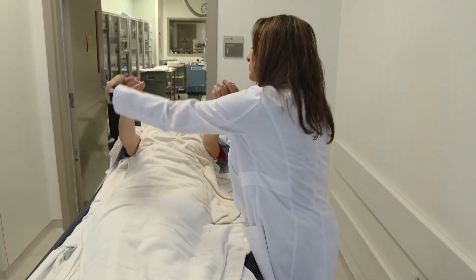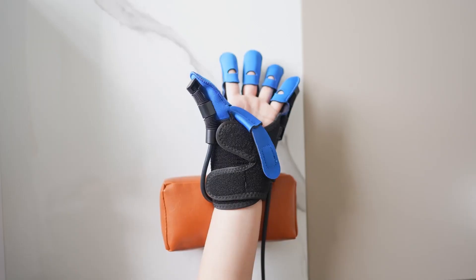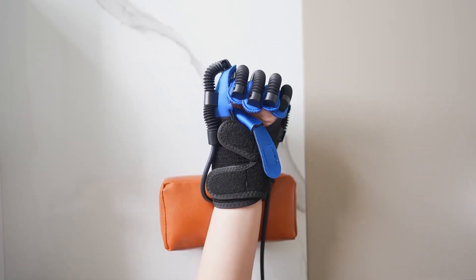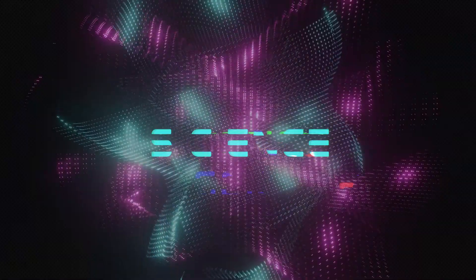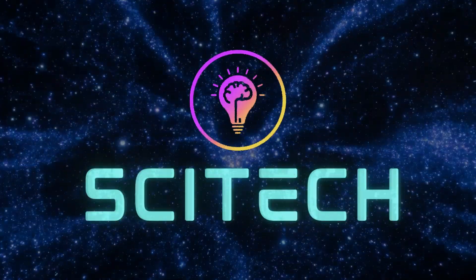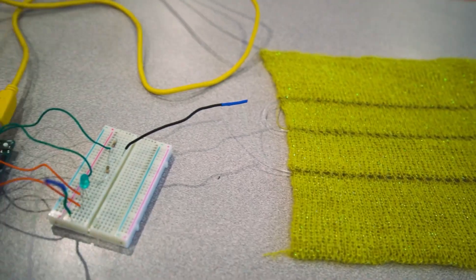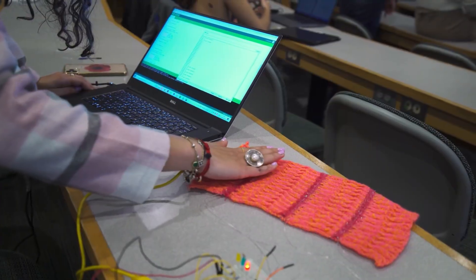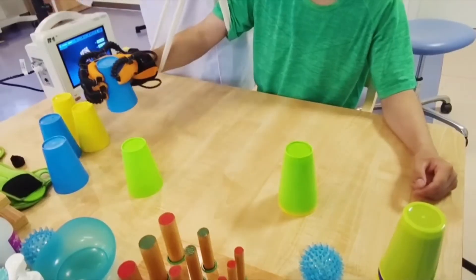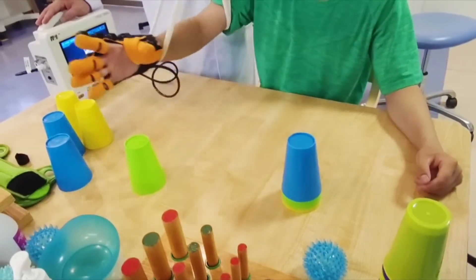Stroke is one of the leading causes of disability worldwide, affecting millions of people every year. But there is a new device that can make a huge difference in their lives. It's called the SmartGlove, and it's a groundbreaking invention that uses wireless smart textile technology to track and transmit hand and finger movements during rehabilitation exercises.